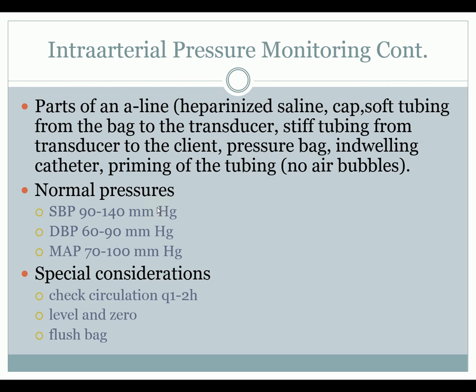Some people now, best evidence-based practice says that plain saline can do just as well as heparinized saline. But if you do use heparin at your facility, it usually will come in a pre-mixed bag for you to use. The reason they're trying to get away from using heparin bags is because it's caused a lot of heparin-induced thrombocytopenia. So if you've got heparin and you're using it in your flush bag, you always want to check platelet counts. This does require informed consent. Remember the Allen test. You'd always want to do that prior to putting anything into the radial artery.